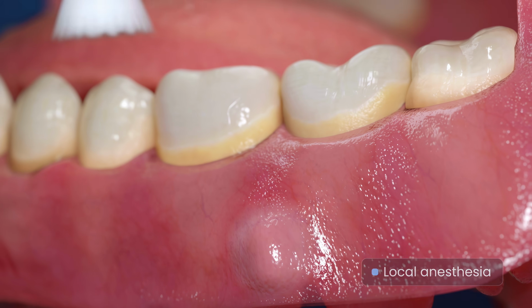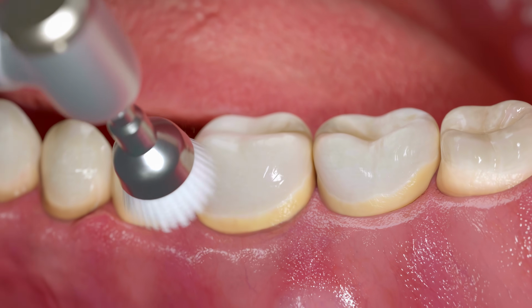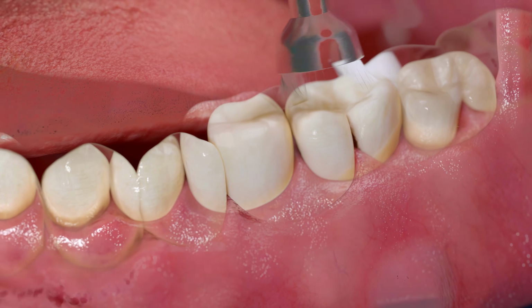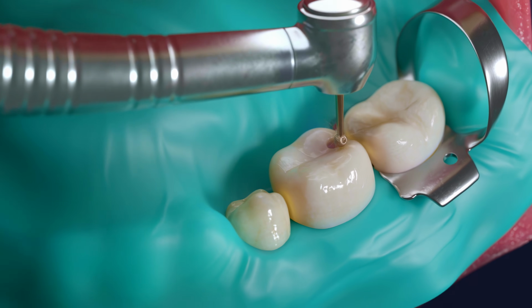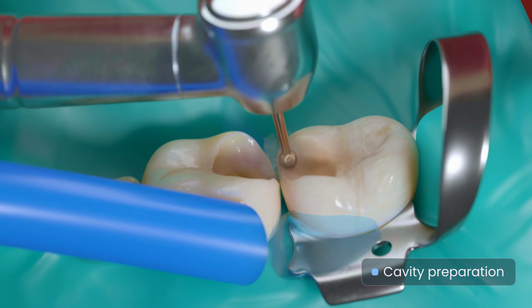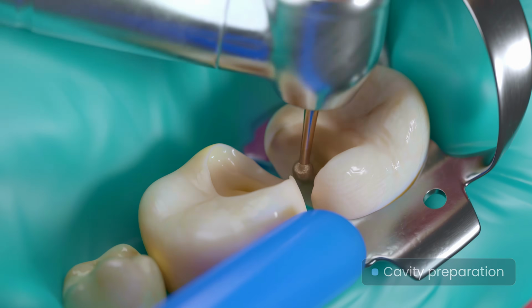Caries is typically treated under local anesthesia. The teeth in the operative field are cleaned of dental plaque. Isolation with a rubber dam helps maintain a dry working field and prevents microbial contamination. The cavity must be carefully prepared to ensure cleanliness and proper shape to support the restorative material.